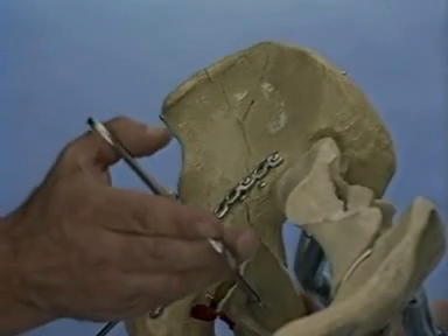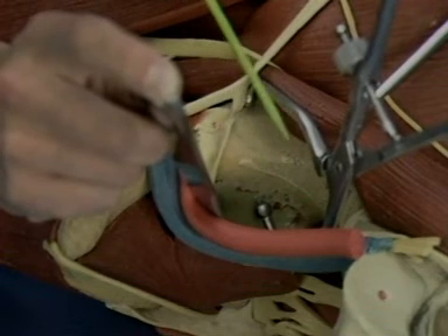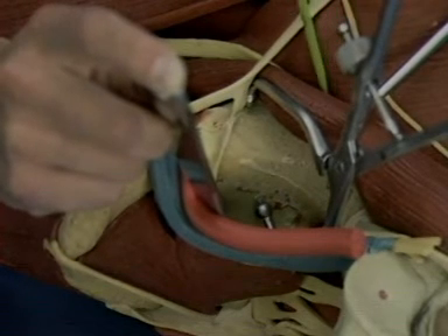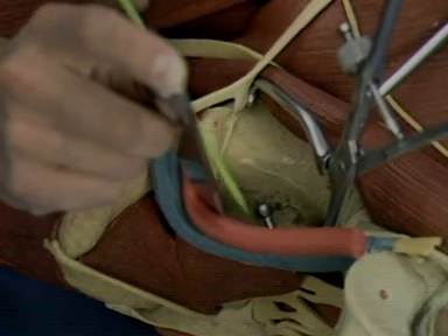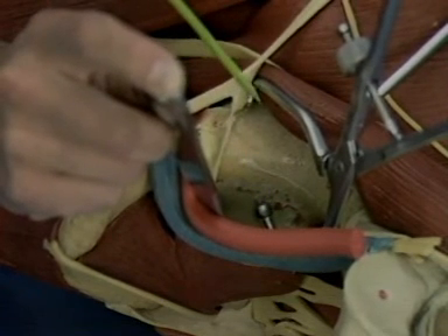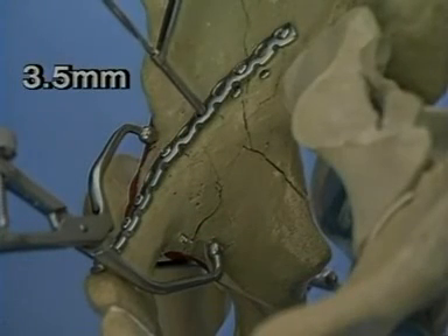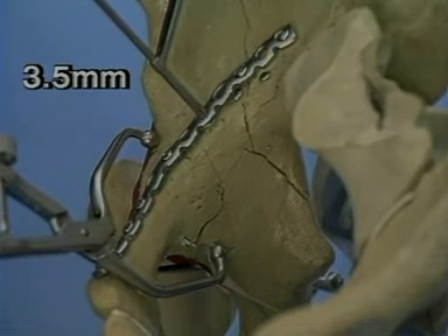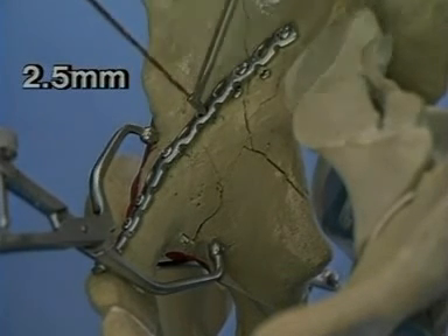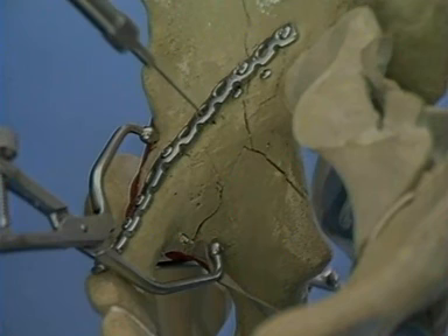The posterior column fracture site is now reduced with angled jaw ball-tipped reduction forceps. The small angled jaw clamp is placed in the second window of the ilioinguinal, just medial to the ilioopsoas and the femoral nerve, and just lateral to the femoral vessels. One tip is seen on the quadrilateral surface, the other tip near the pectineal eminence. 3.5mm lag screws are now placed through the plate holes into the posterior column. These screws must closely parallel the quadrilateral surface in order to avoid entering the joint. The 3.5mm drill bit is first used for a gliding hole, followed by the 2.5mm drill bit. The depth is measured and the screw inserted.